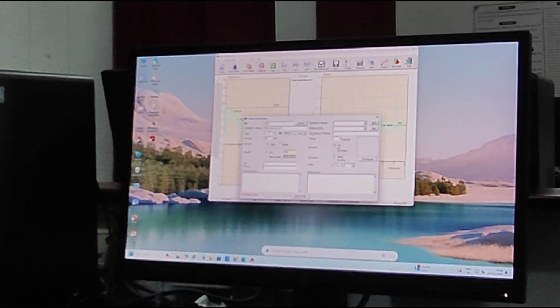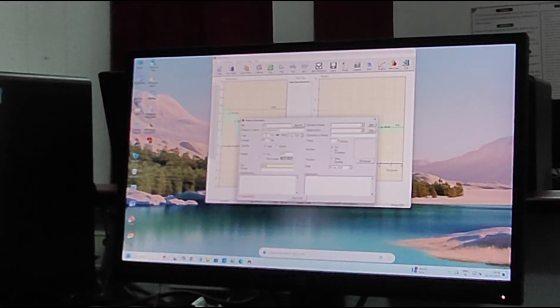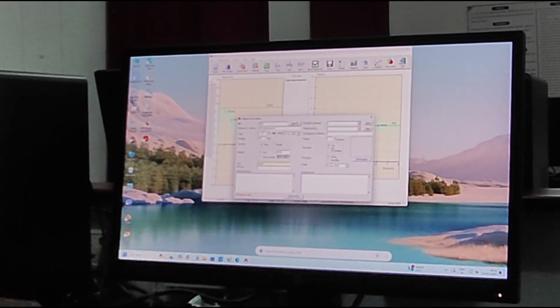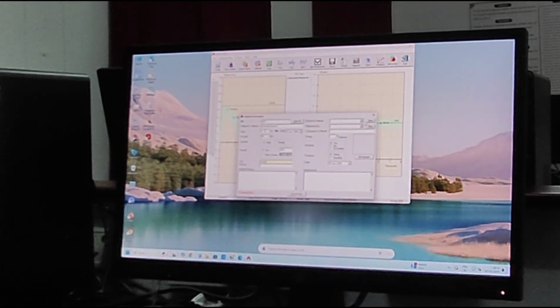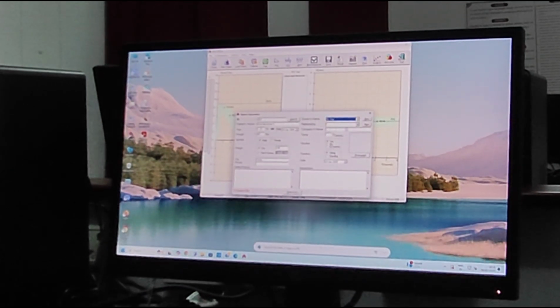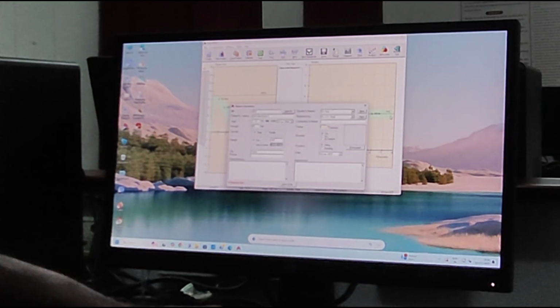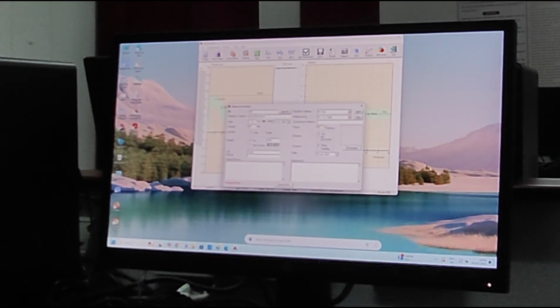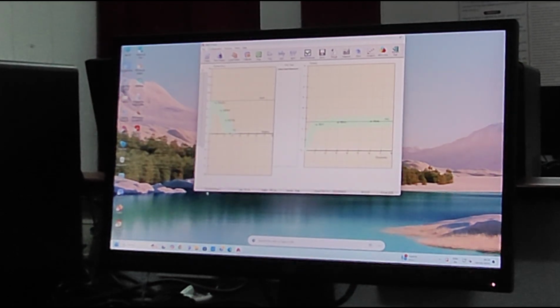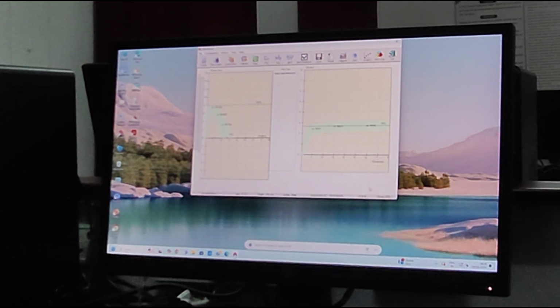Once the basic details are entered, we can also choose the doctor details. The basic details are stored, and will be displayed in the analysis chart after entering the data.